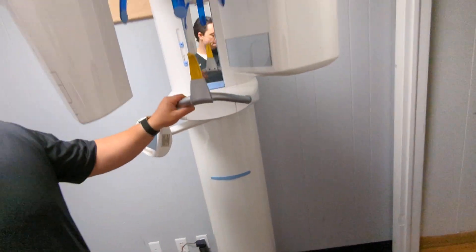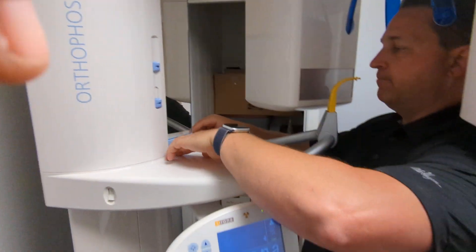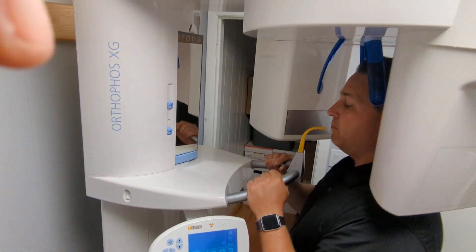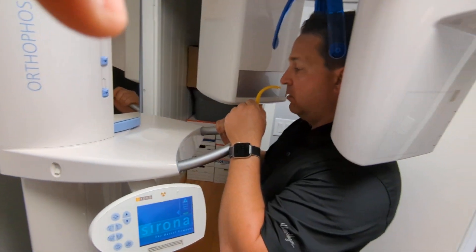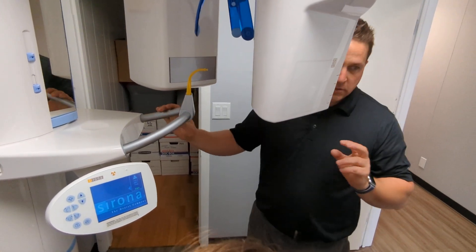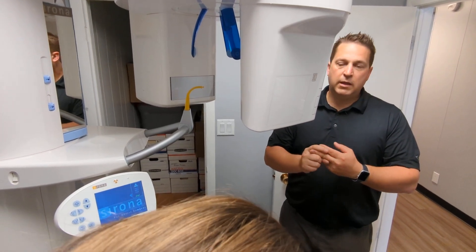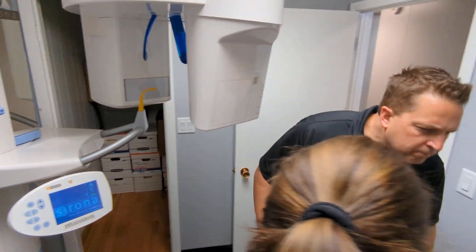Walk the patient in — okay, don't bump your shoulder. You can stay on this side or that side and turn the mirror. You're going to line them up, raise or lower them, and make sure the occlusal plane's down right. Once you have that, the last two things you're going to say: 'tongue to the roof of your mouth and lips tighter on the bite piece.' Tell them to close their eyes too because some people try to follow the machine. Then swallow, tongue to the roof of your mouth.